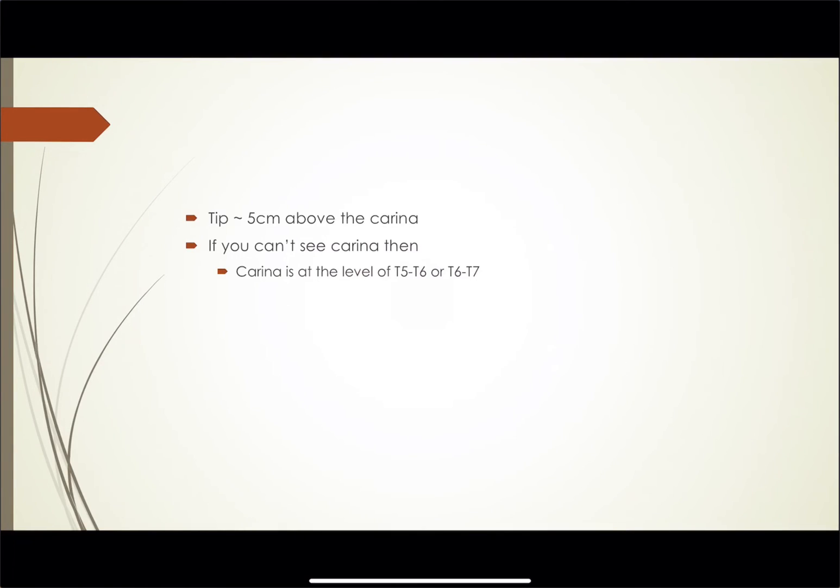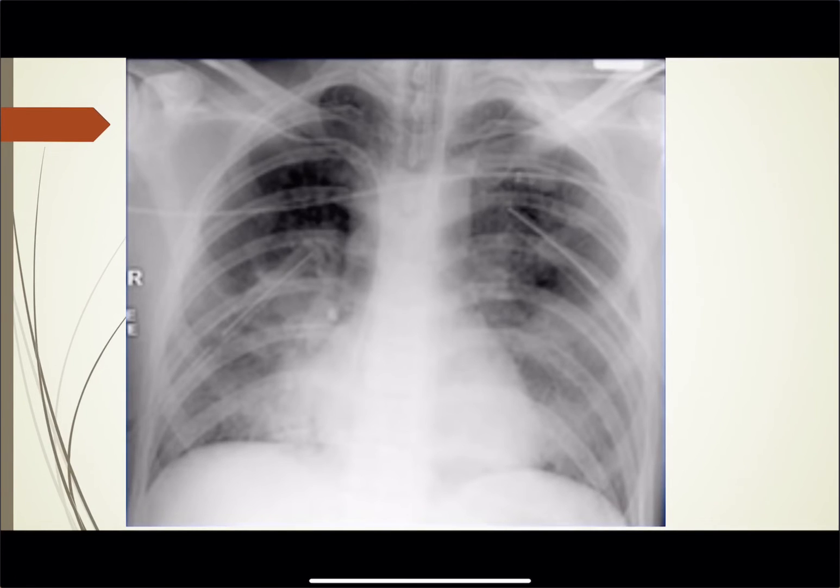The tip of the ET tube should be around five to six centimeters above the carina. If you can't see the carina, the carina is going to be somewhere around the level of T5, T6, T6-7.